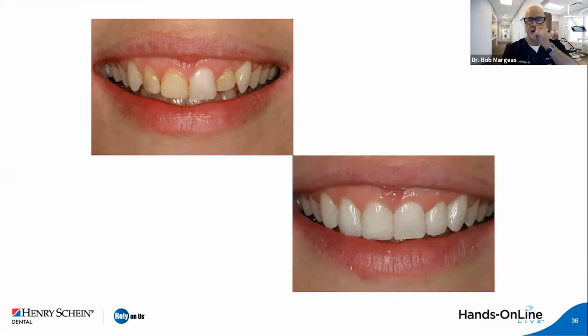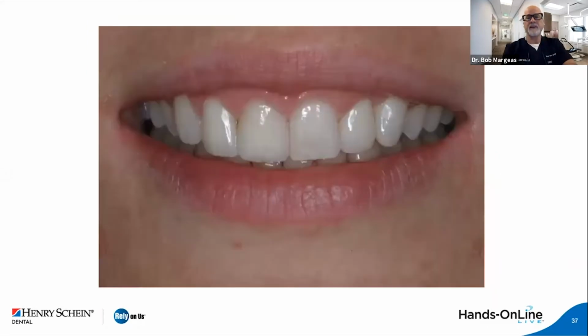Before and after. And here it is at a 5-year post-op. And you can tell that the materials hold up very, very well. And you should be able to get a number of years out of your composite resins. When I do a composite resin, I expect 7 to 10 years of success on that, as long as the patients are not using their teeth as weapons. So let's go to the visualizer and go through step by step, and then we'll answer some questions that you may have if you have any questions.